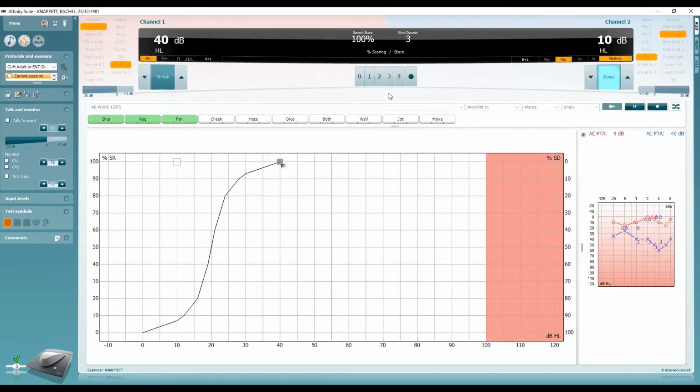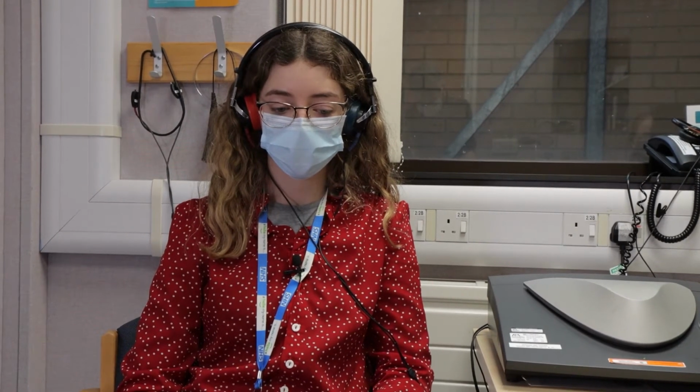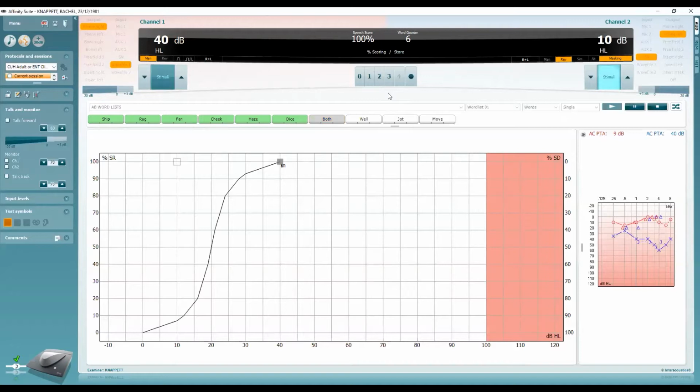Fan. Cheek. Haze. Dice. Both. Well. Jot. Move. Okay, so we've reached the end of word list 1 and the score is 100%. I'm going to store that.